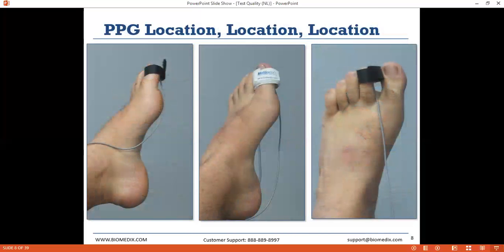On the patient's foot, you're 99% of the time going to place the probe on the patient's toe, a little higher up on the toe. You're not placing it on the pad where you take a toe print. You're placing it a little higher up, closer toward the knuckle or the bend, the back of the great toe, so to speak.